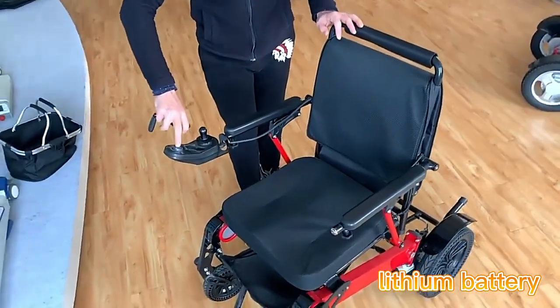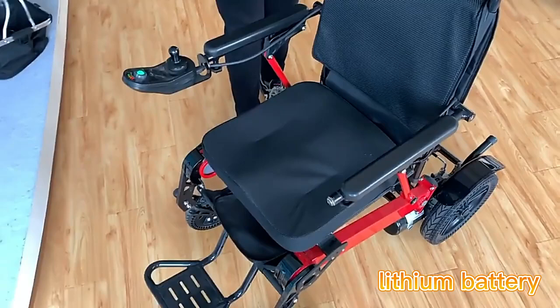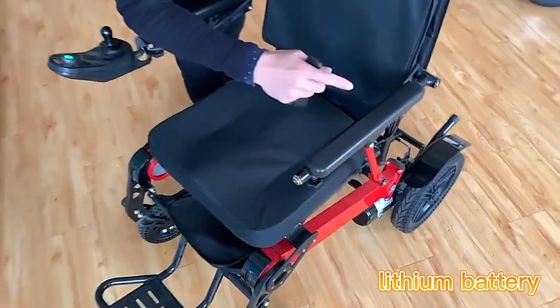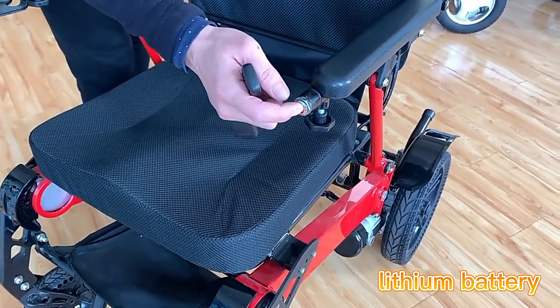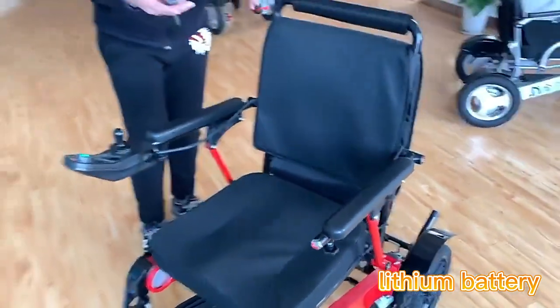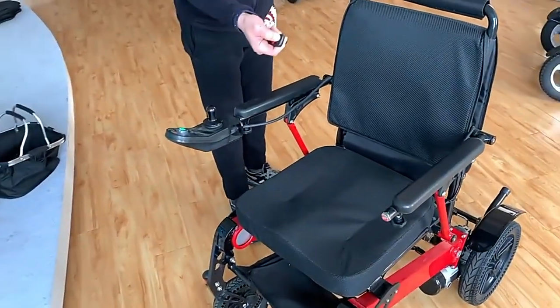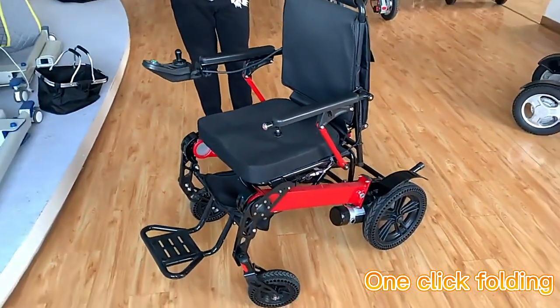First of all, we need to switch on here, and also there is a safety switch here in case of any misuse of the remote. Once we see the light here is on, then we can just keep touching the remote and then it will fold automatically.